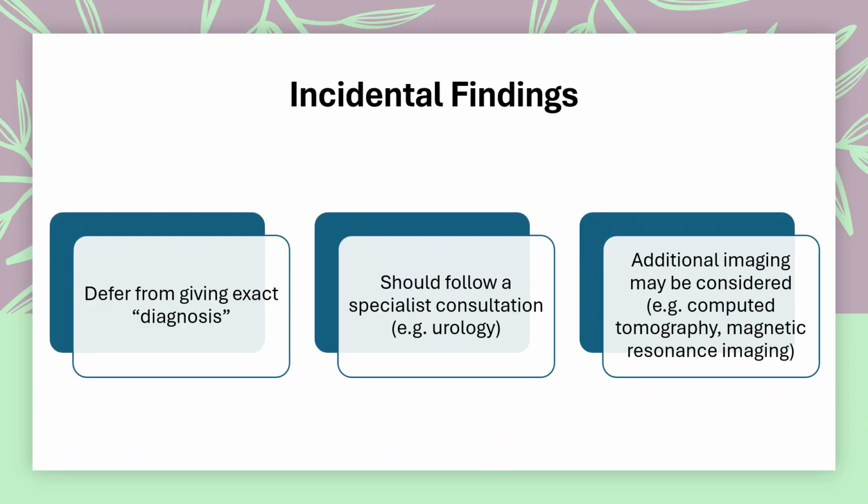So what about incidental findings? Point-of-care ultrasound is by no means a comprehensive exam. So when you see something, it is important for us to defer giving an exact diagnosis. You should follow up with a specialist consultation, which in most instances will be urology, which may decide whether additional imaging is needed, such as computed tomography or magnetic resonance imaging.